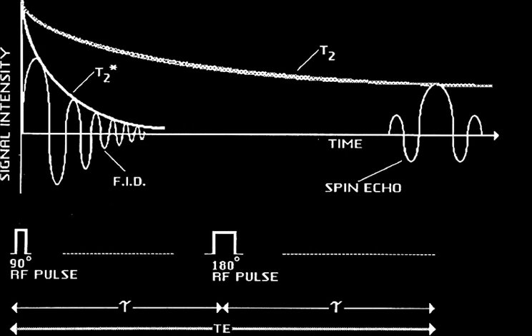Once you have the bulk magnetization vector spinning around the XY plane at the Larmor frequency with a non-zero value, you have basically a spinning magnet. And any metal you have in the area, like the coil in a receiver coil, will have a current induced in it, just like we talked about before. So it's that bulk magnetization vector inducing a current in our receiver coil right next to the knee, and that current in the receiver coil is what you feed into the computer.